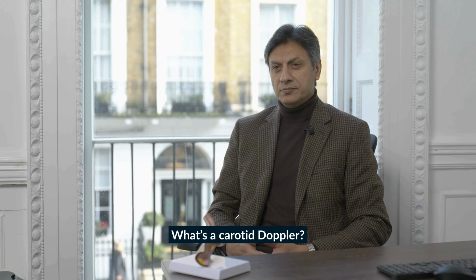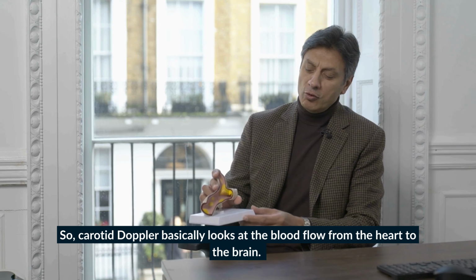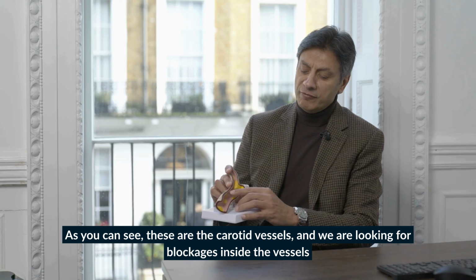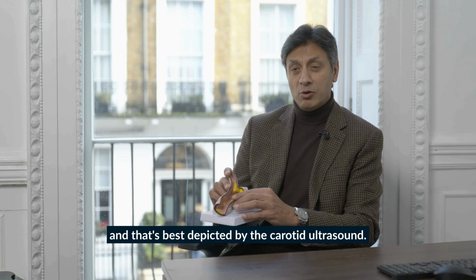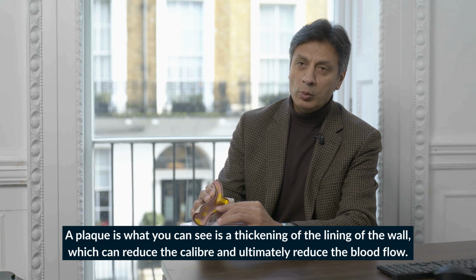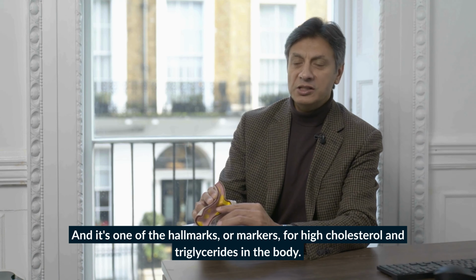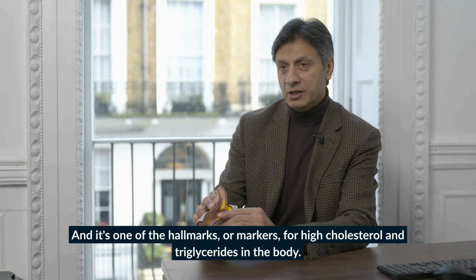What's a carotid Doppler? So carotid Doppler basically looks at the blood flow from the heart to the brain. As you can see, these are the carotid vessels, and we are looking for plaques inside the vessels, and that's best depicted by the carotid ultrasound. What is a plaque? A plaque, as you can see, is thickening of the lining of the wall, which can reduce the caliber and ultimately reduce the blood flow. And it's one of the hallmarks or markers for high cholesterol and triglycerides in the body.